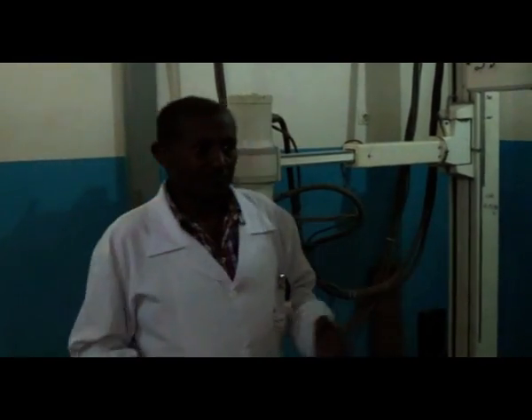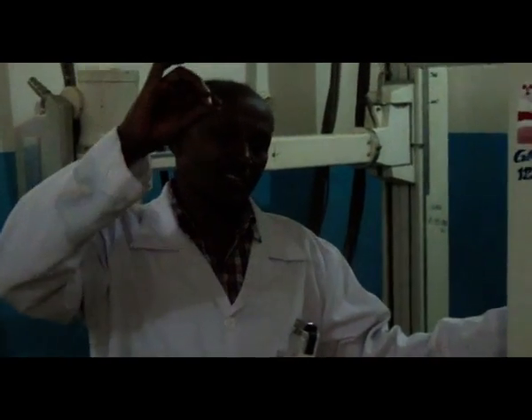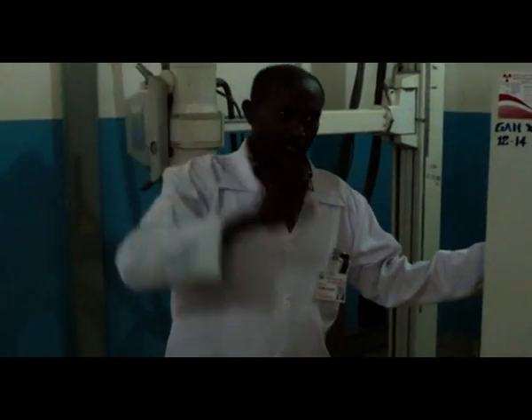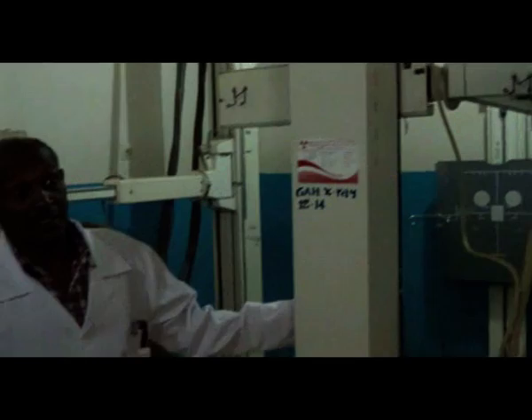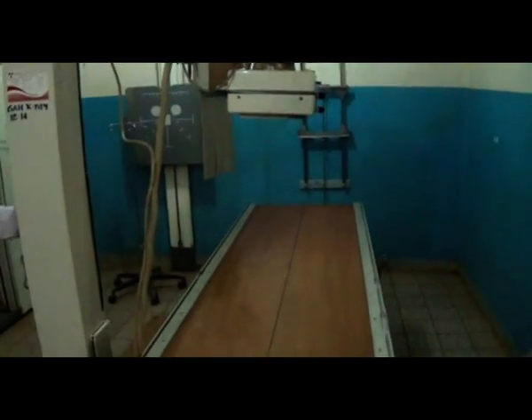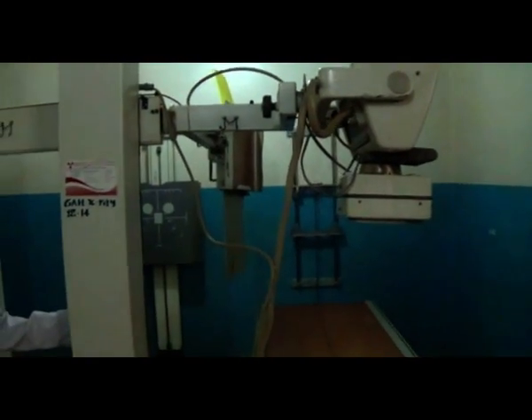So you mean that its deviation rate is very high? Yes, it deviates, sometimes very high, or sometimes very low, and the radiation authority is inspecting each time, and they are not happy with this machine that we are using, and we completely need an X-ray machine now. Which is very new. Yes, we need the best one.